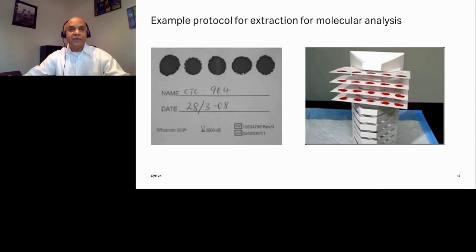And surveillance for large-scale epidemiological surveys can be performed rapidly, enabling strategic decisions to be made about targeting at-risk populations. This may be particularly valuable for monitoring herd immunity and the extent of vaccine coverage at a time of eradication.